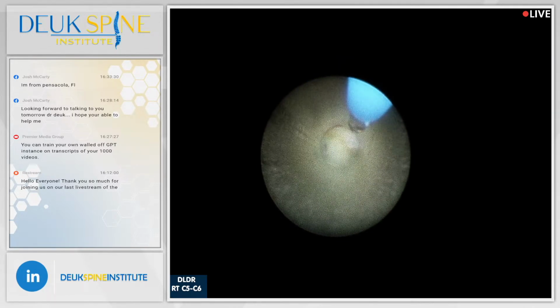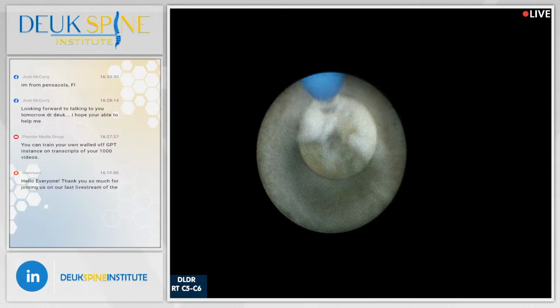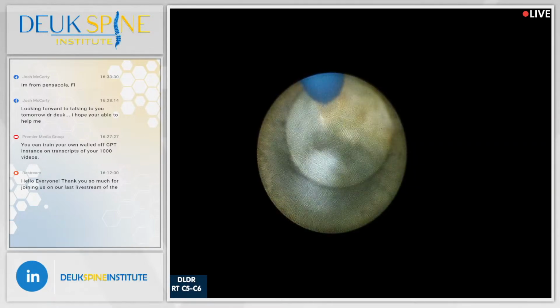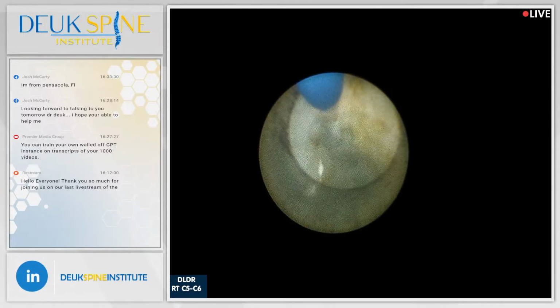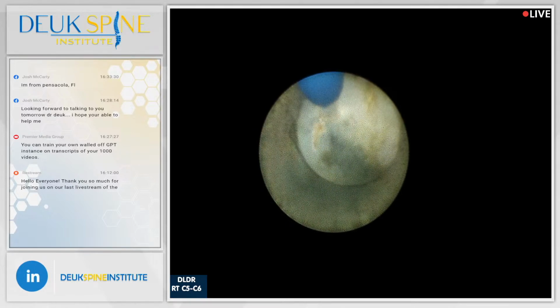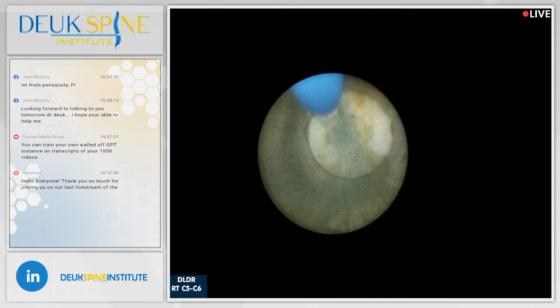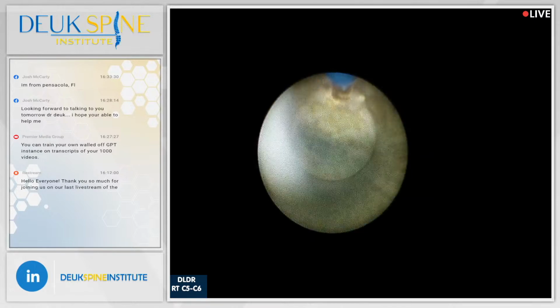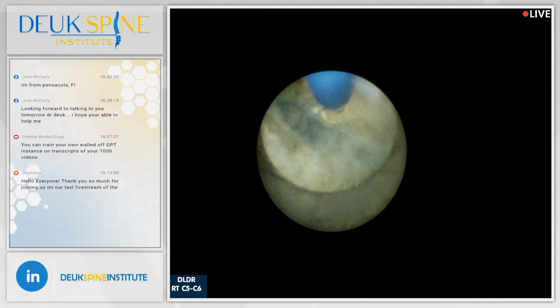That's it. Let me just look the other way. We're done. Let me just finish this. Just a little bit here, we'll be done. I don't see any more herniation besides this. This is on his left side. Big tear, it's going to need to heal. Beautiful. This is the annular tear. And this will heal. It just takes a long, long time.